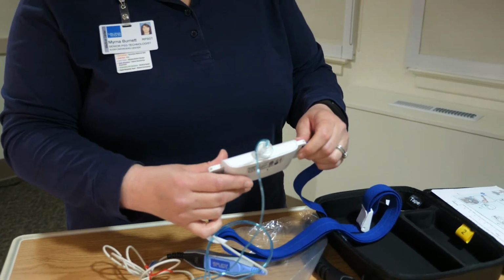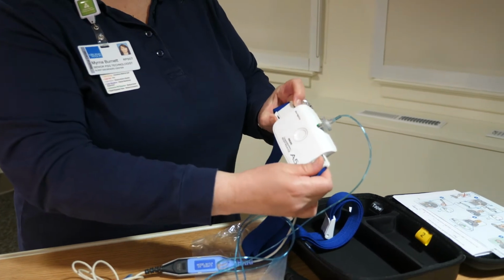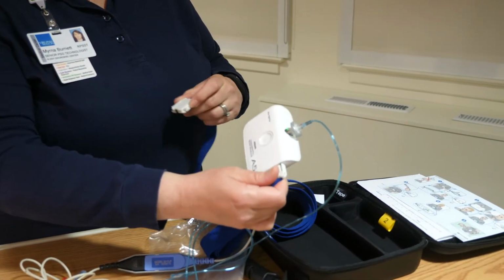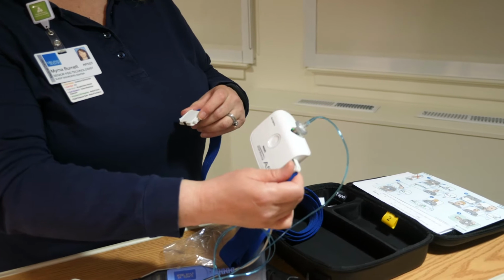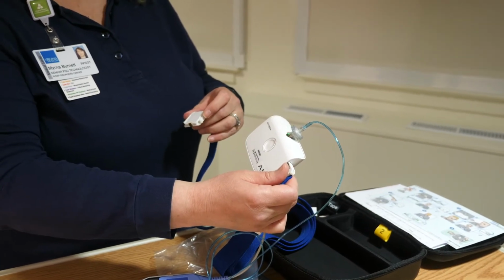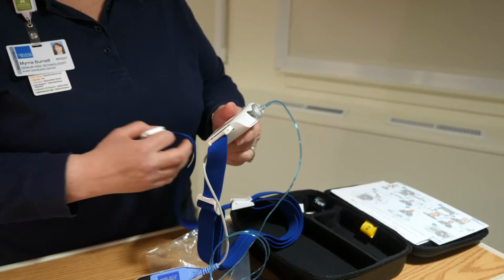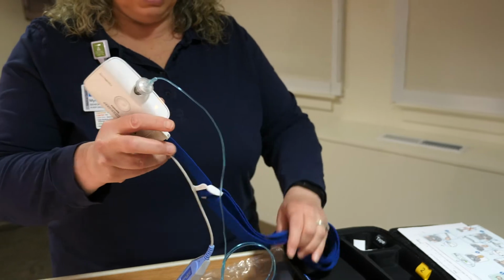So in the morning, when you're done doing the study, all you have to do is just pinch one side together, slide it out, leave it out. The unit will realize that that circuit loop has been cut, and the unit will turn itself off automatically after about 2 or 3 minutes. Okay? So then, to put the device on yourself at home, it's kind of like putting on a belt.